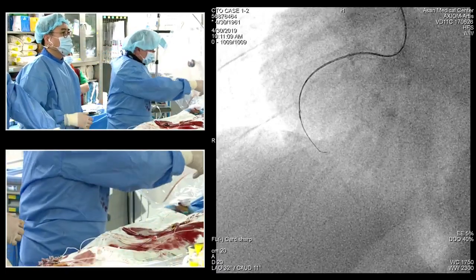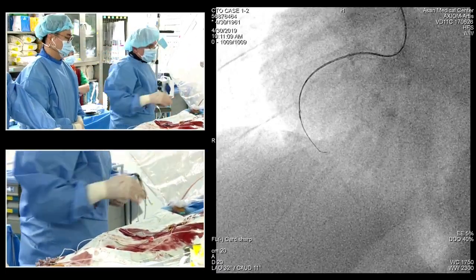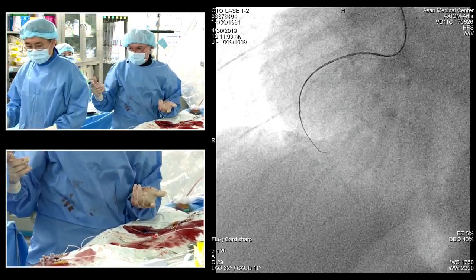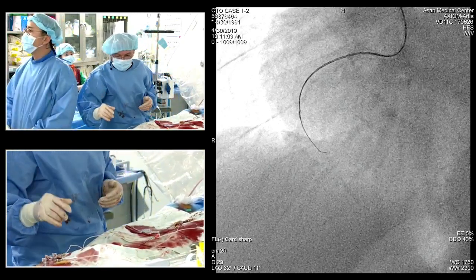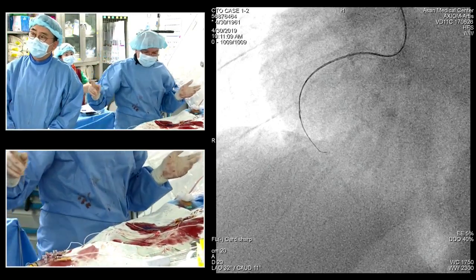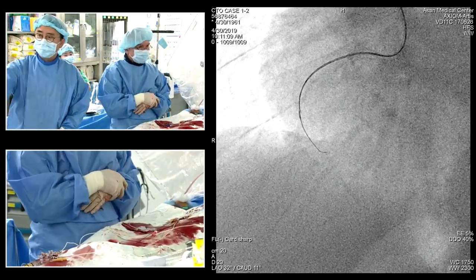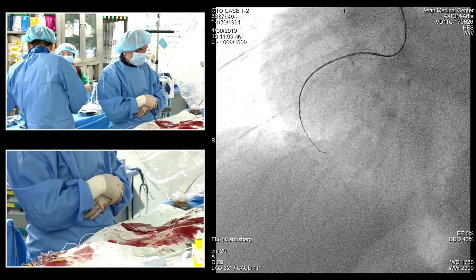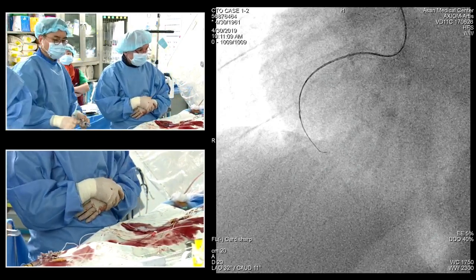It's very tight there. I would have to dilate. I had a hard time to dilate. So get me a Caravel and a Whisper. Whisper wire and Whisper, a Caravel. Whisper. Caravel 150? Yeah, 150. Check ACT, do we? Yeah, yeah. Let's check ACT before we go retrograde.